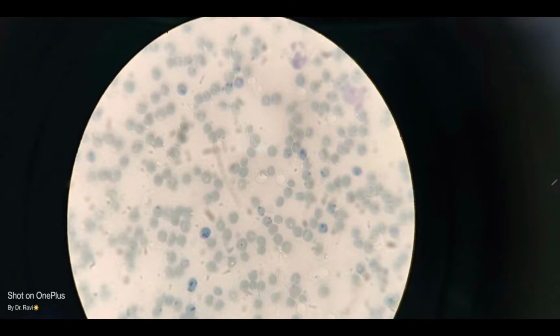Now here is an image which came to our hospital. Here we can see the retics in this smear: 3, 4, 5, 6, 7, 8, 9, 10, 11. So the retic count in this patient is around 11 to 12 percent, and this is a case of CML. As I have mentioned, leukemia is one of the causes of increased retics.